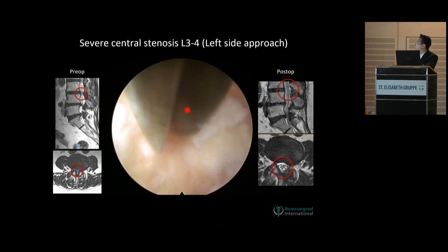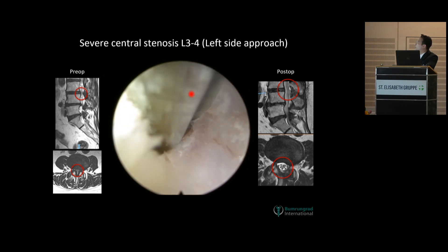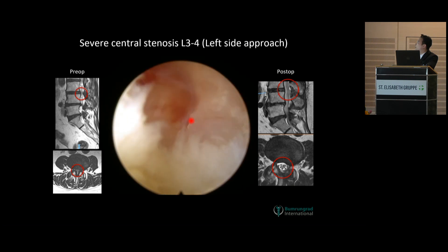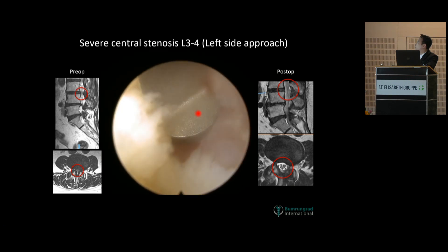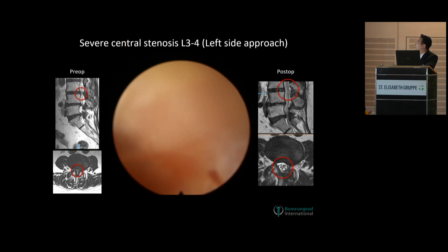The technique is to press the drill down deep enough to cut at the side. This is the lower lamina. Always see the tip so you know what you are cutting, so you won't injure the neural structure. Use the curette. This is the insertion of the flavum, caudally.